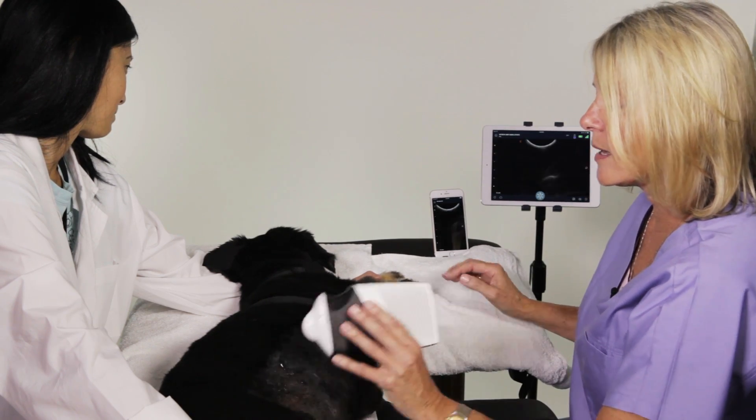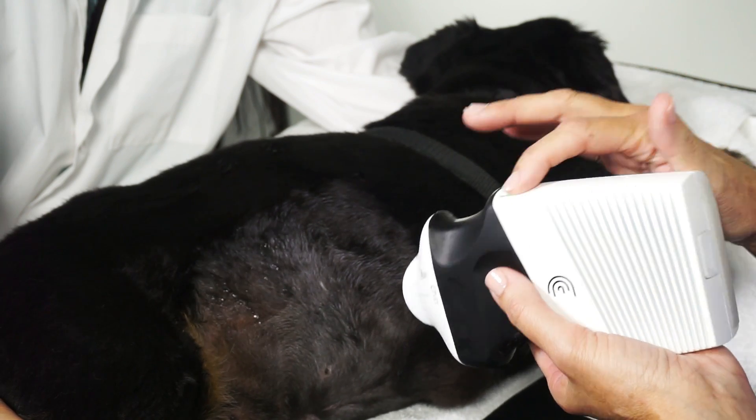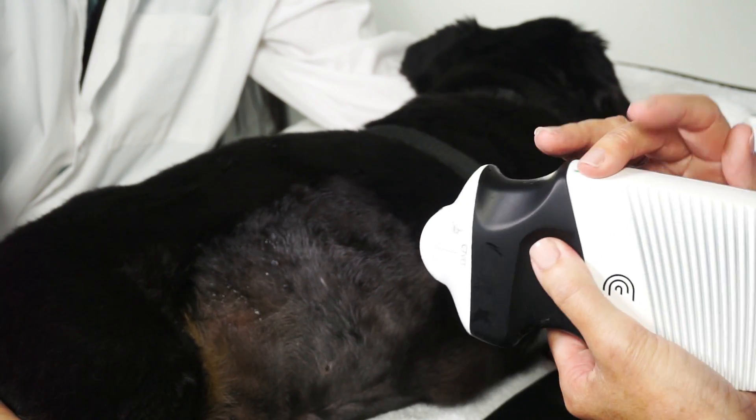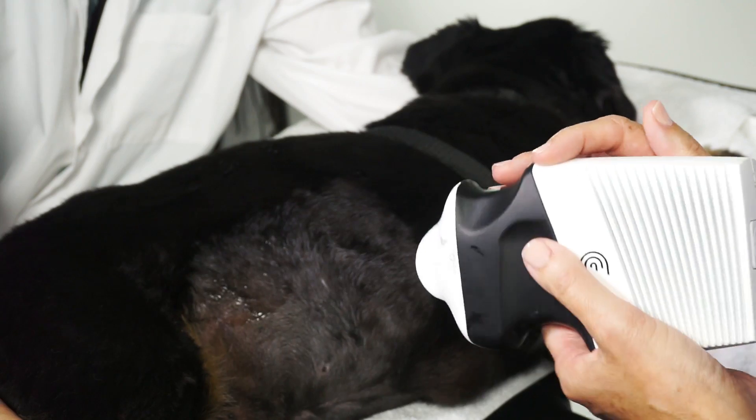Now I'm just going to show you some scanning. Orientation of the transducer, or of the scanner, is the light. That usually, and probably should, try and scan so that this points to the head or to the patient's right.